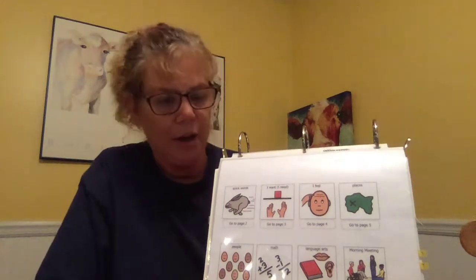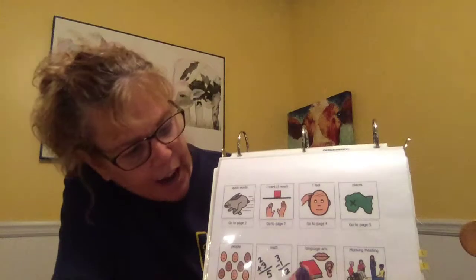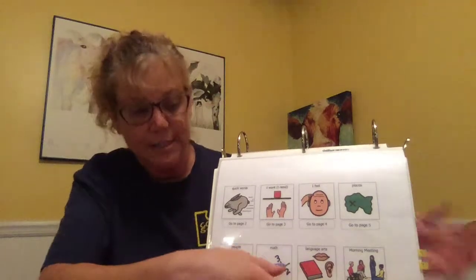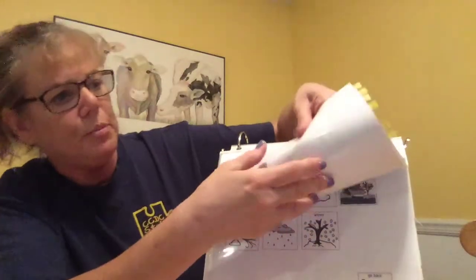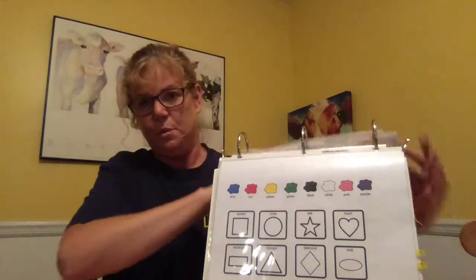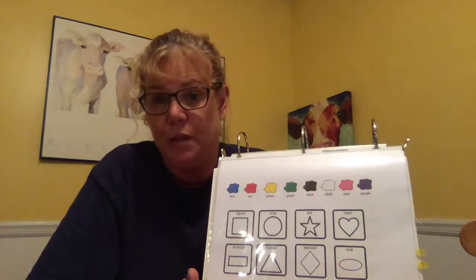I set up a couple lessons in here. I did add math, language arts, and morning meeting tabs. And I set up a page for John for math. And I thought this would be something that might be used with patterns.